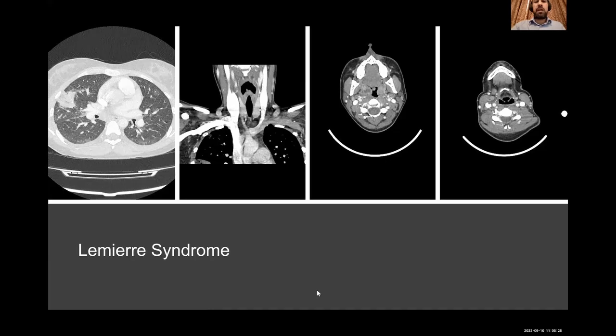Very good, Mahdi. These are in keeping with Lemierre syndrome. Thrombosis, infection. The problem started with infection; the patient could be an addict because it is the right side, through the right side pathway, which is very difficult in a normal person. The patient has infection in his mouth or mouth floor, thrombosis of the internal jugular vein, then septic thrombus of the lung.